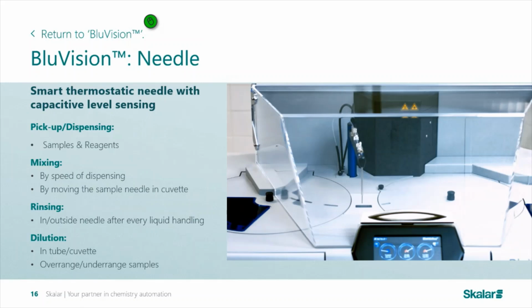The needle is thermostated to a user definable temperature, and what that ensures is a consistent temperature during the pickup and transfer of samples and reagents to the cuvettes, ensuring that all samples are treated the same.